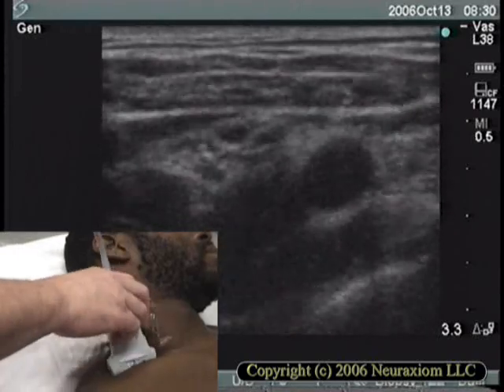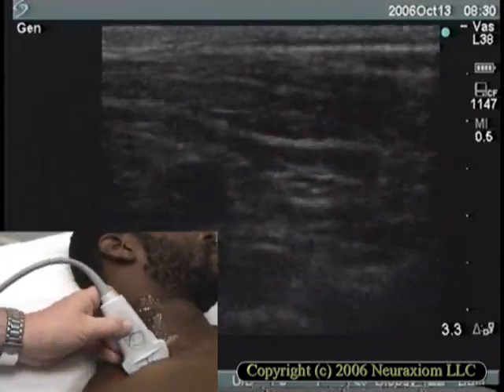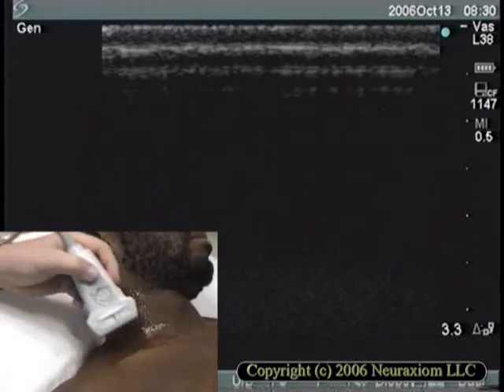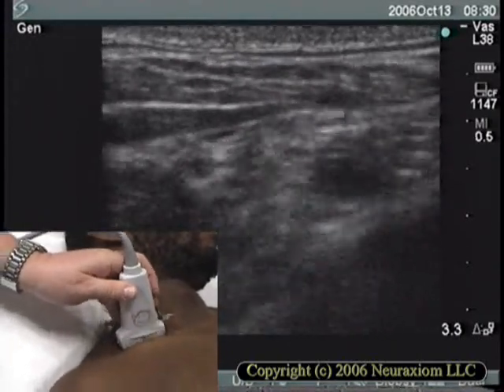I'll change hands so that my big old hand isn't in the way of the scan. Now I'll demonstrate the same scanning technique, left-handed. What talent, huh?